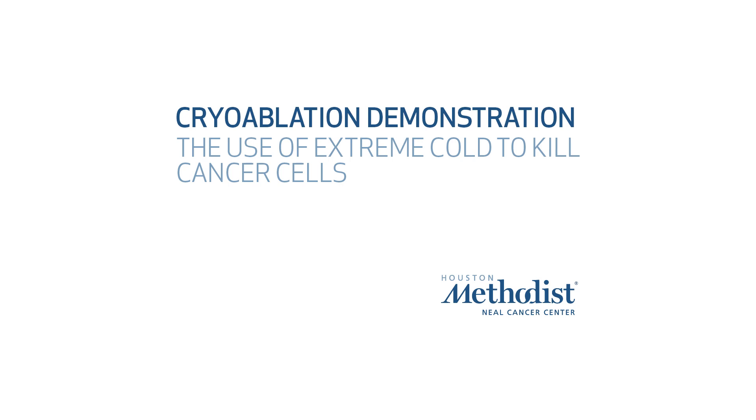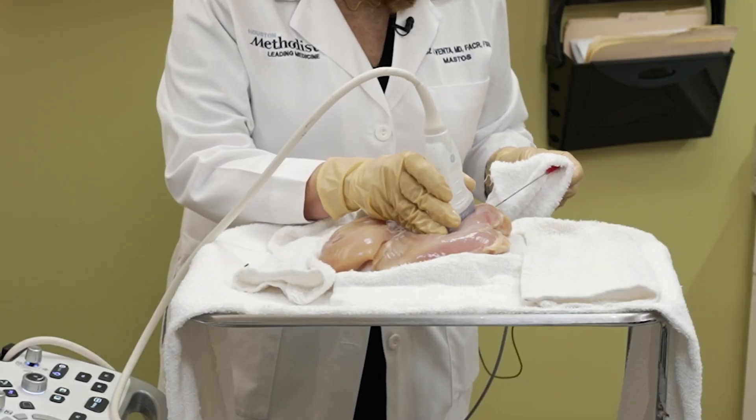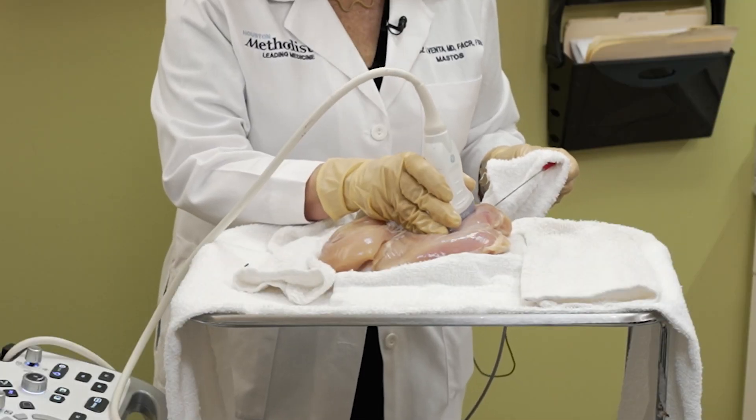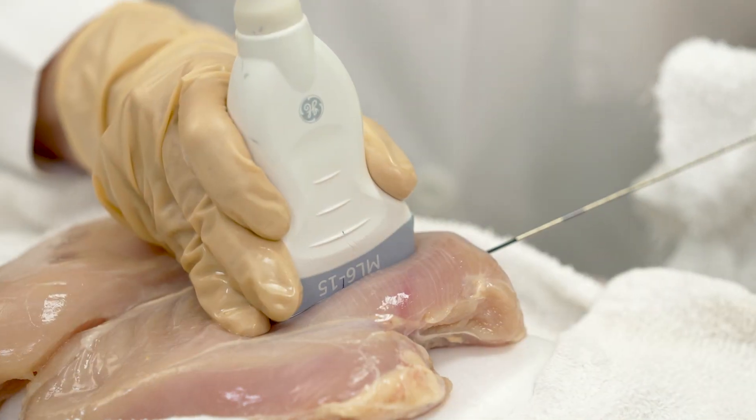In this demonstration, we will explore the process of cryoablation using a phantom with a target embedded within it.